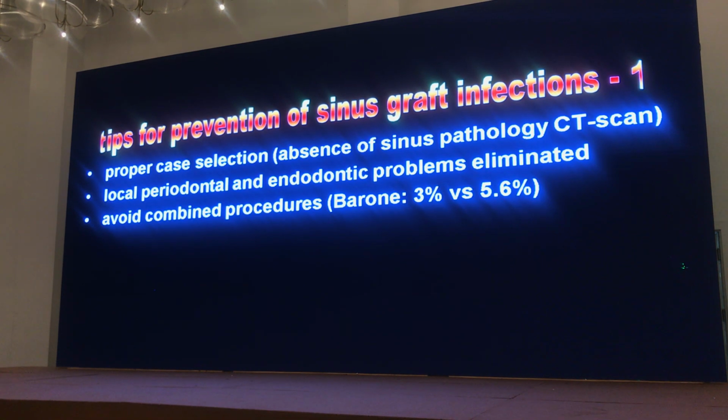Why? Because now you have a membrane underneath your incision line. And if your incision line breaks down, you both are infected, your ridge augmentation and your sinus graft. So I tend to separate them. I'll do the sinus graft first, and come back and do the ridge augmentation later. That way I don't have that increase.